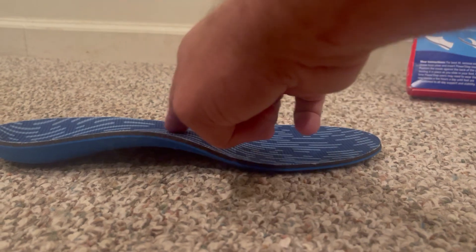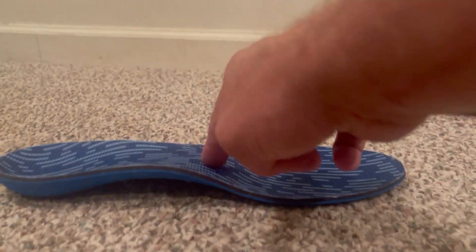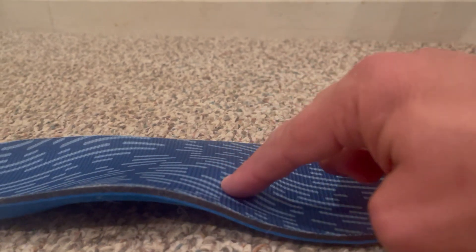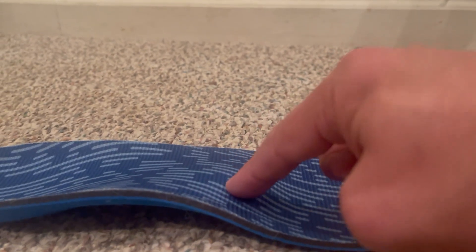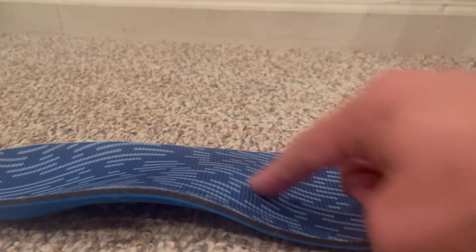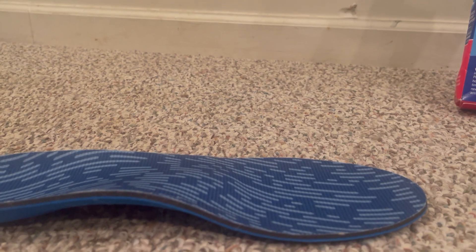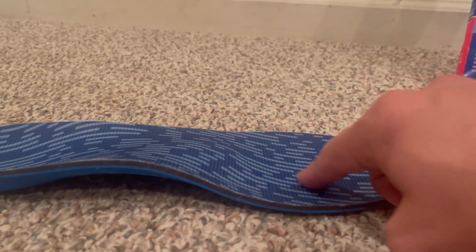The major difference with the Plus is that there's a metatarsal pad right here that helps to alleviate ball-of-foot pain. When you put this in your shoe, you definitely feel it in the middle of your foot — it raises the pressure off the ball of your foot.